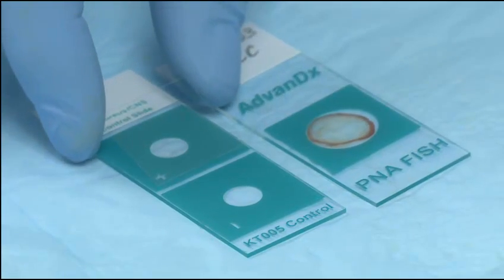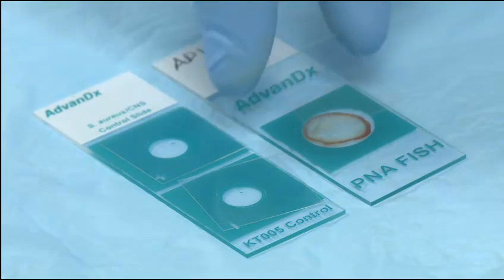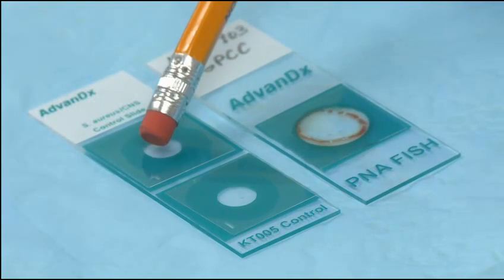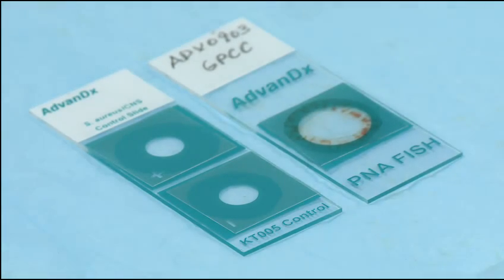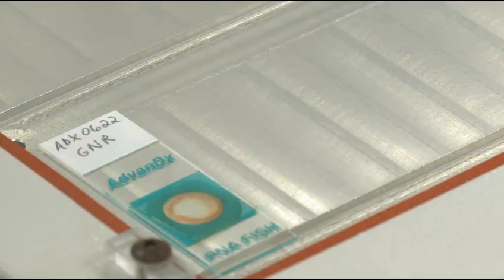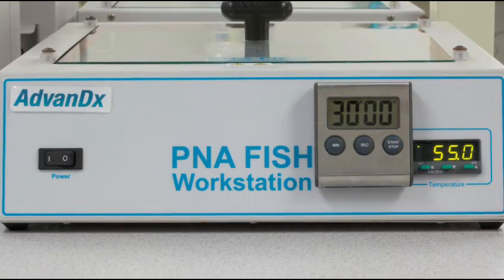Add cover slips to each well. Press firmly on the cover slips to ensure even coverage of the well and to remove any air bubbles. Place slides on the P&A FISH workstation and hybridize at 55 degrees for 30 minutes. That's step 2.